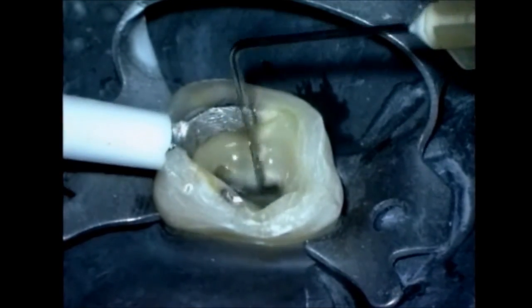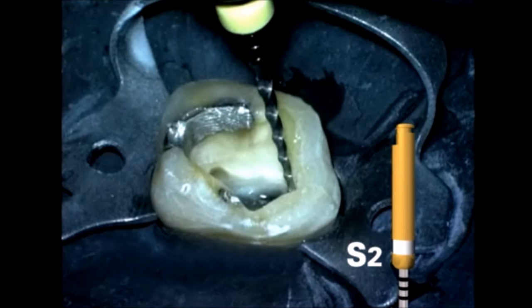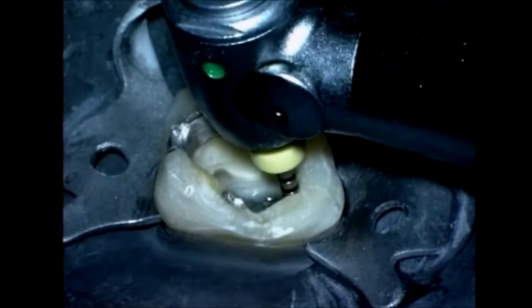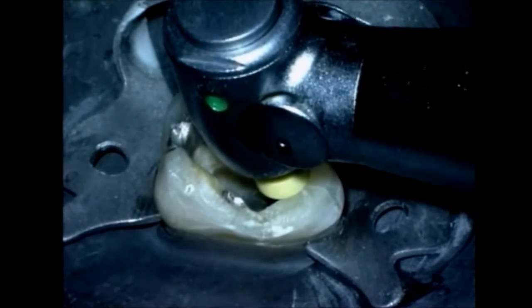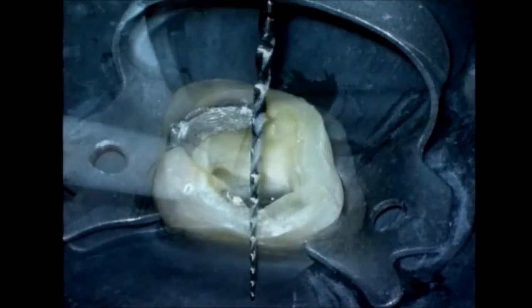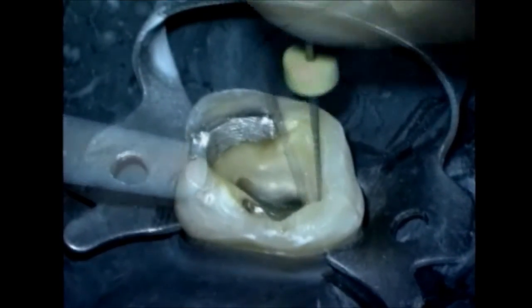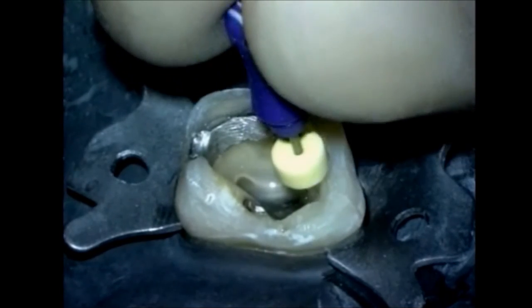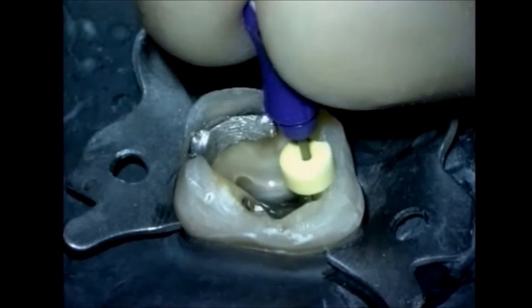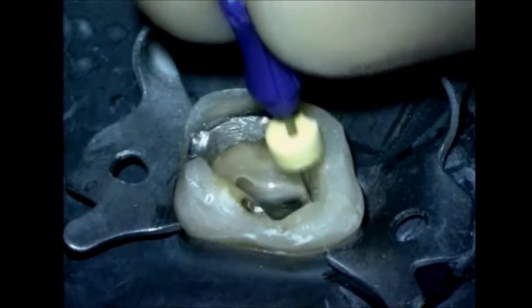Following the use of Shaper 1, we irrigate, recapitulate, and re-irrigate. This gives us confidence to proceed with Shaper number 2. Shaper number 2 will generally follow the glide path and achieve length on its first pass. When we're at length, the instrument is immediately withdrawn as the shape has been cut. Again, we'll irrigate, recapitulate, and re-irrigate. The 10 file is gently placed to length. Patency is again maintained. Little short amplitude strokes assure the glide path and pave the way for the 15.